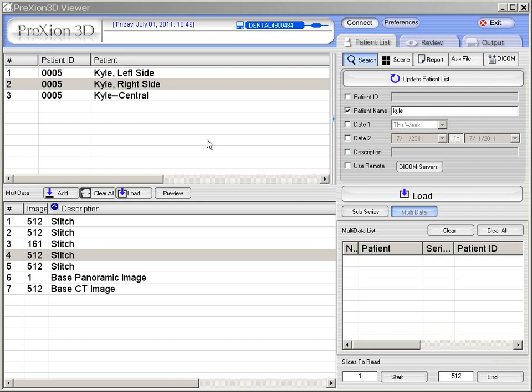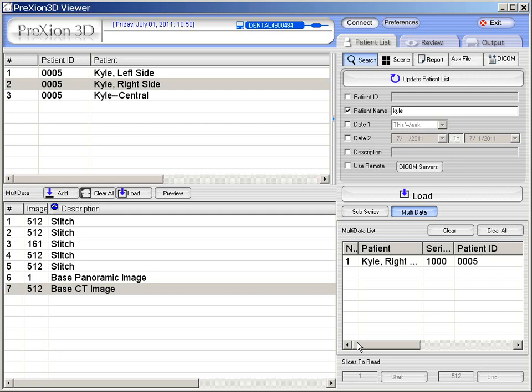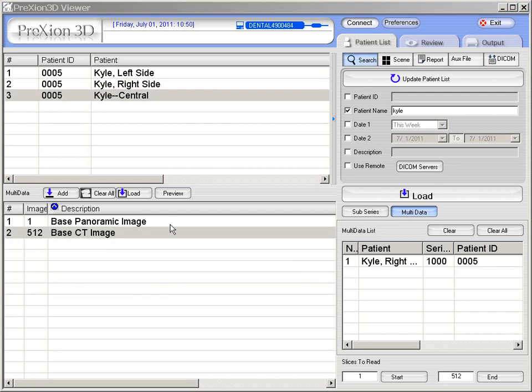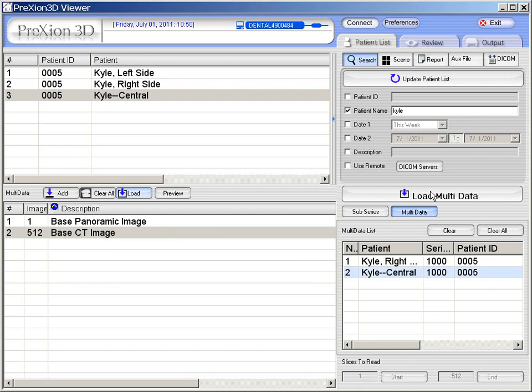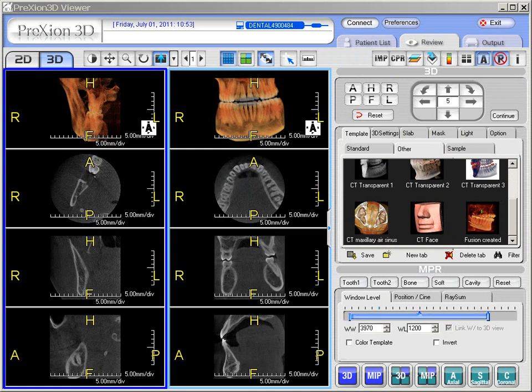After the cone beam scans are performed on the Prexion 3D scanner, they display here in the patient viewer list. In this example, we've got the right side and we'll take the 512 slices and add them to the multi-data list. Next, we go to the central portion and add that also to the multi-data list. Here the multi-data list icon is displayed, so to load this we click on the multi-data icon and it's in the process of loading. In the multi-data list page, we have our right side and the central with the corresponding axial, coronal, and sagittal planes, respectively.